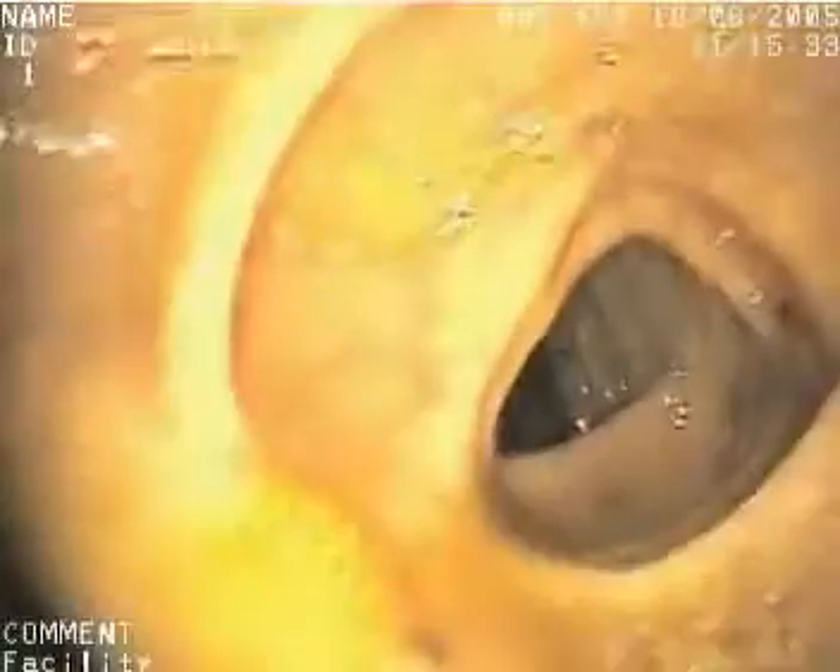The colonoscope is gently pushed into the anus and the doctor examines the inside of the rectum. It is then moved into the colon so that the doctor can examine the lining of the colon. The colonoscope is flexible so the doctor can move it around the curves of the colon.